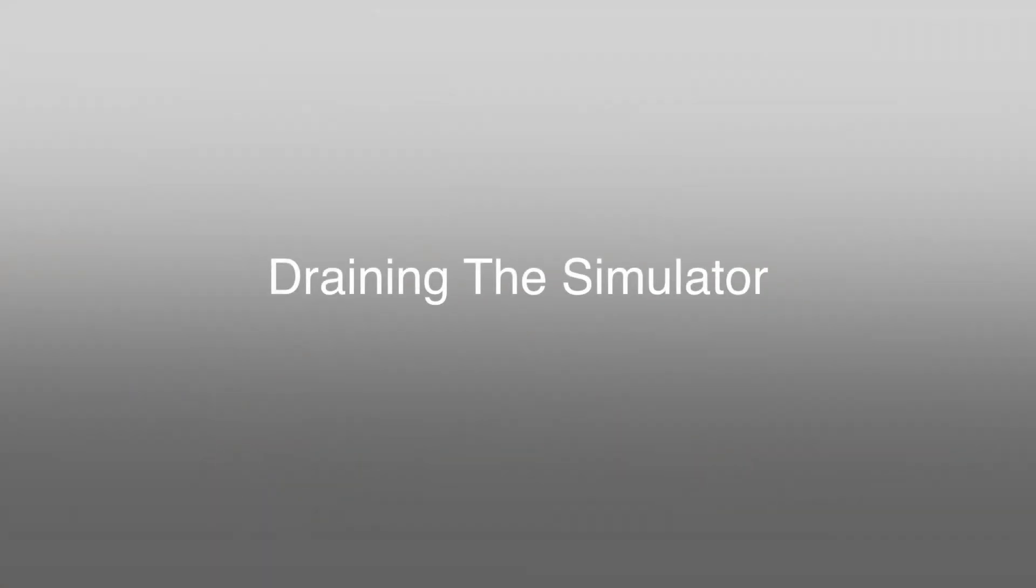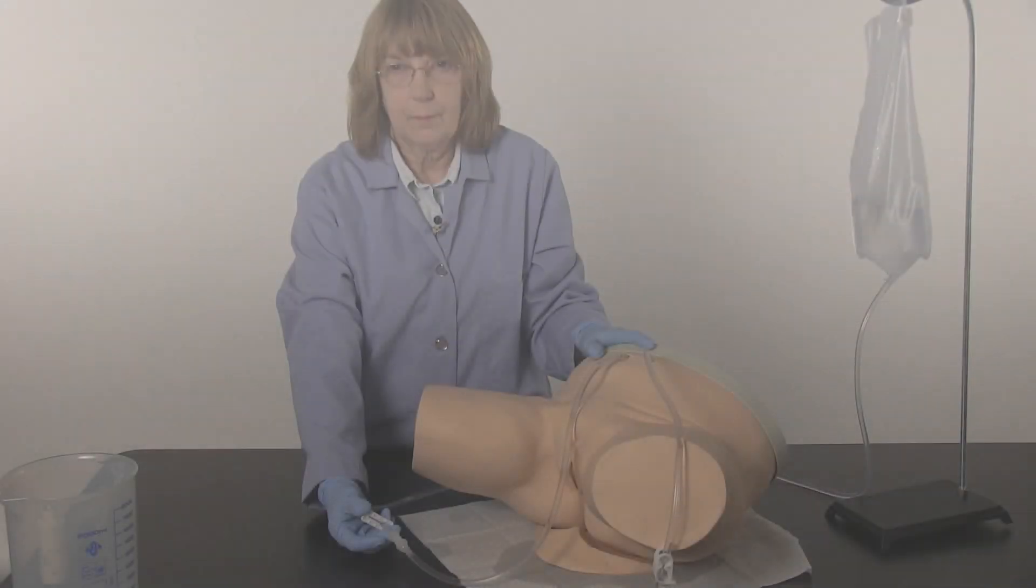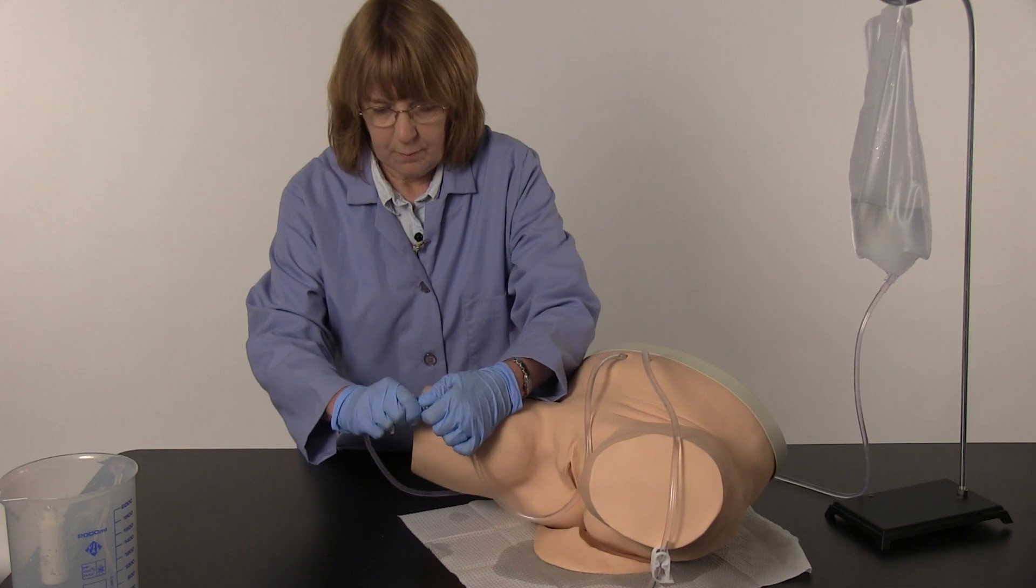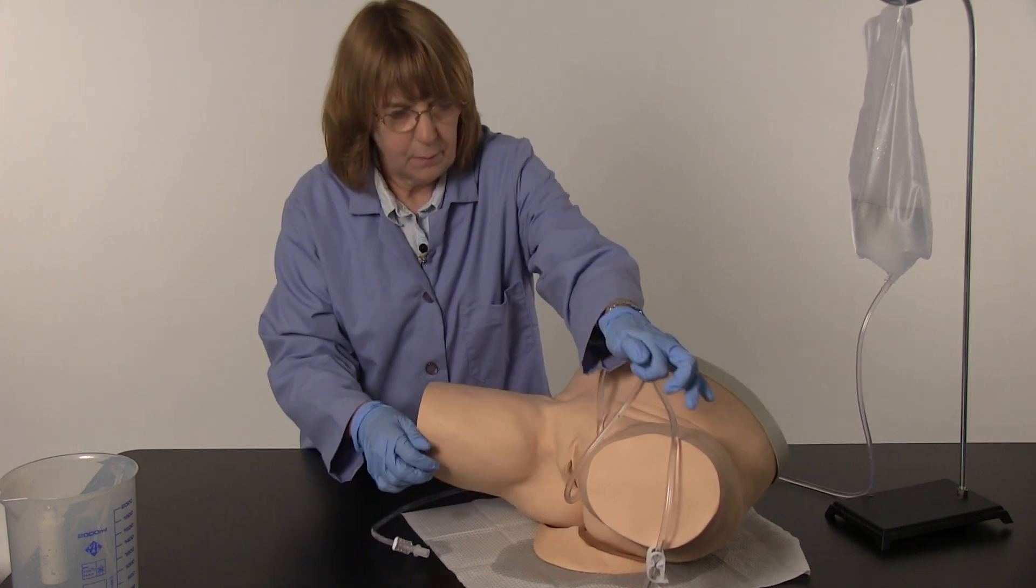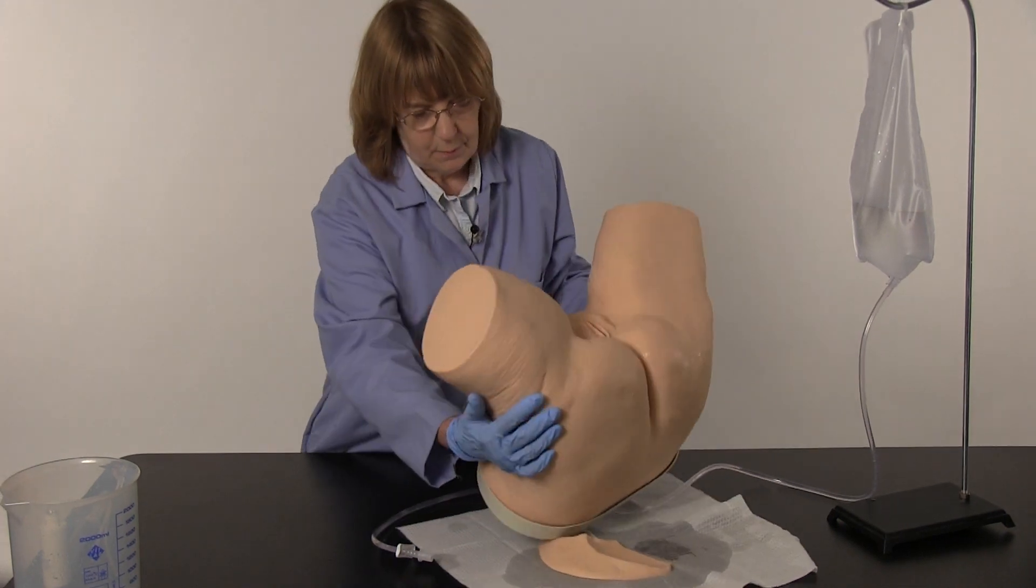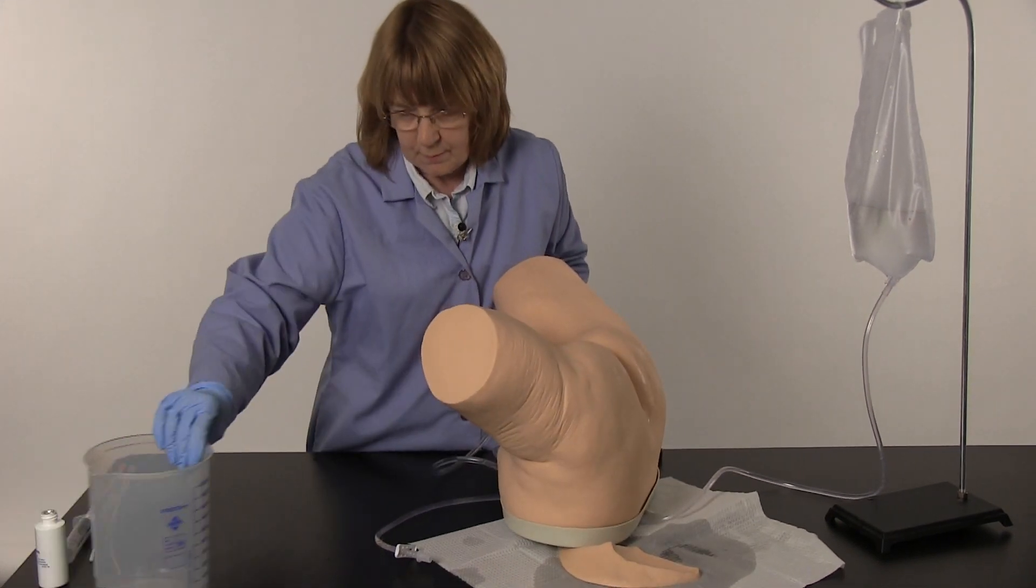Draining the simulator. Perform this procedure near a sink or with a water-safe basin. Slide the clamp closed on the fluid administration set. Disconnect the quick disconnect fittings. Turn the simulator over onto its plastic base.